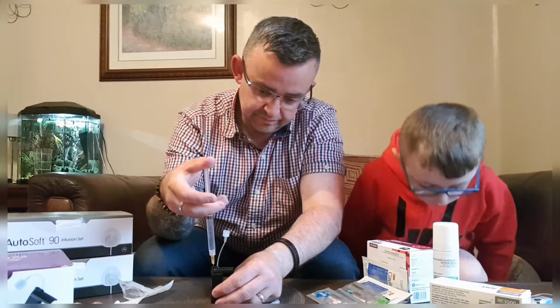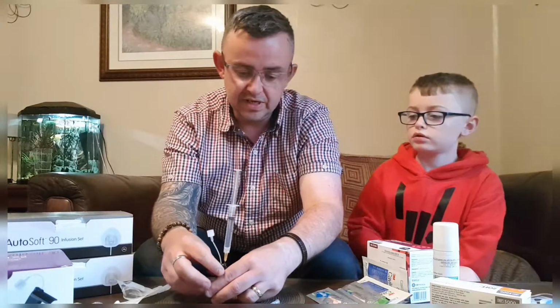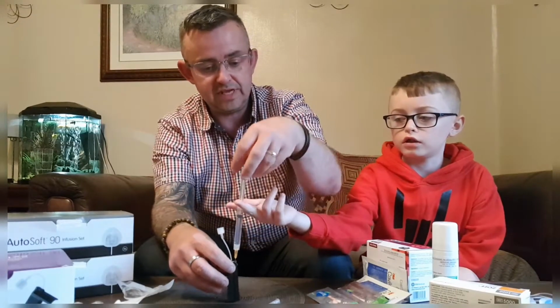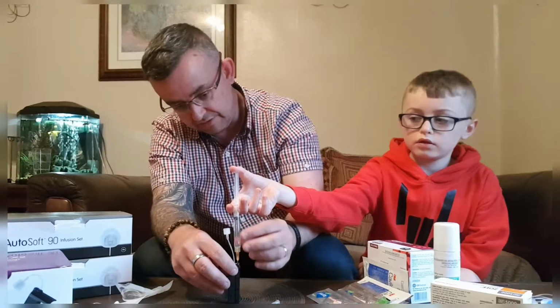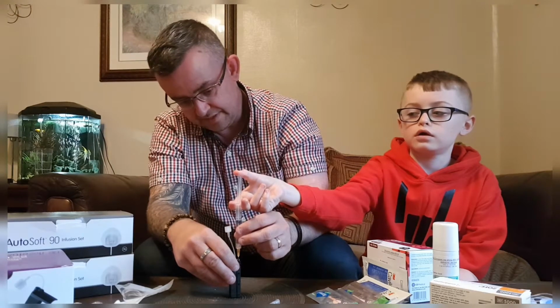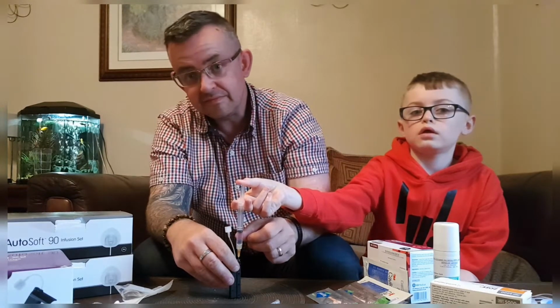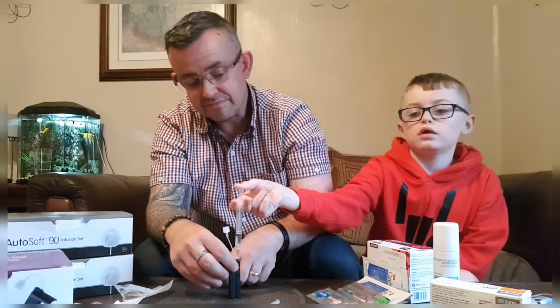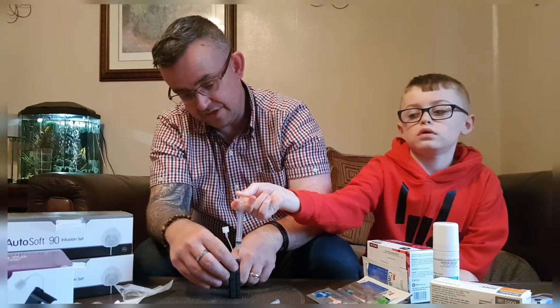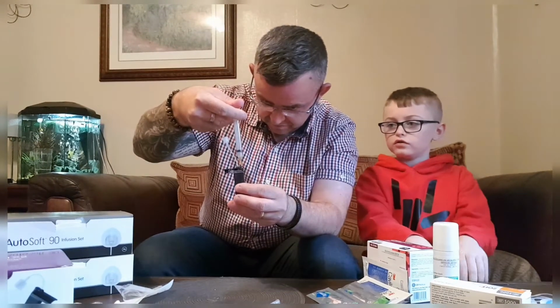And then, do you want to do this bit? Okay. Very gently, two fingers like that, and then your thumb on the top, underneath these two wings. Now, slowly. Is it doing it? Yeah. Good lad. Keep going till you can't go no more, or you get to the bottom.